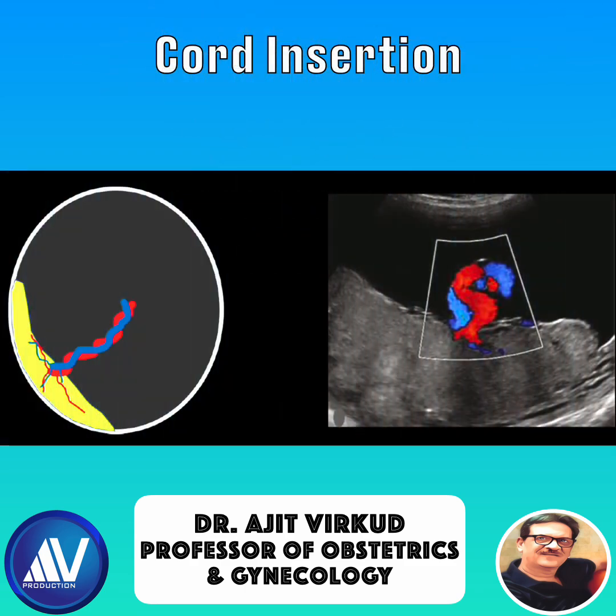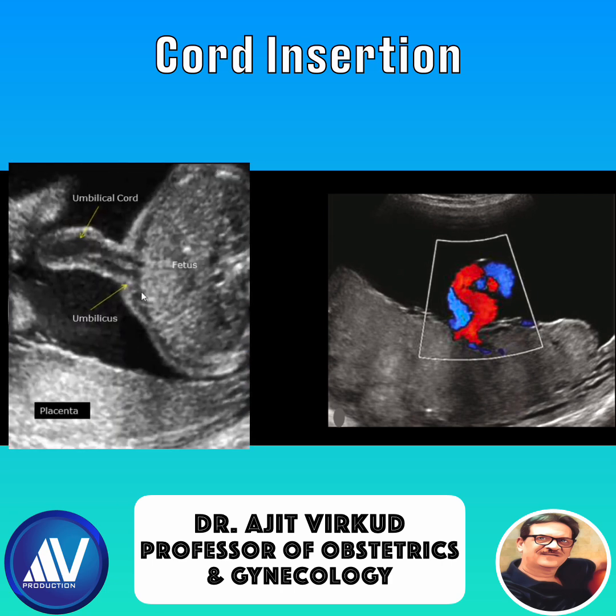In normal cord insertion, the umbilical cord inserts at or near the center of the placenta. In the fetus, it enters at the umbilicus. The ultrasound image shows a normal central cord insertion, which must be assessed with color Doppler to track fetal vessels. Insertion of the umbilical cord to the fetus must be examined; follow the vessels cranially to ensure normal abdominal closure, helping differentiate from omphalocele or gastroschisis.